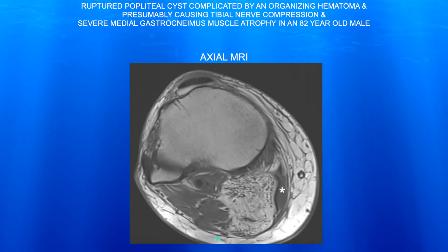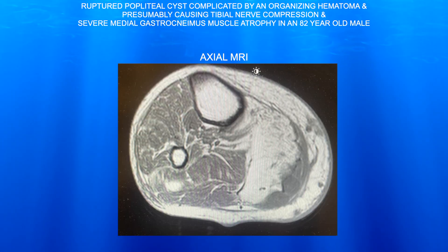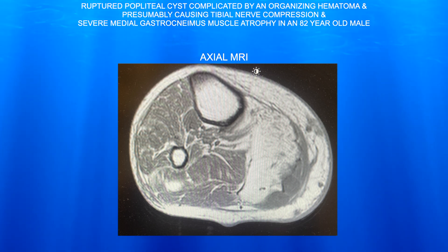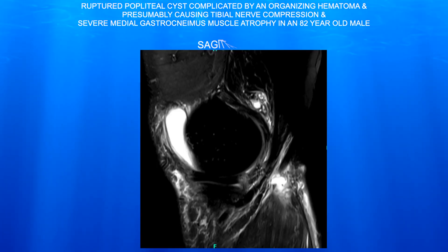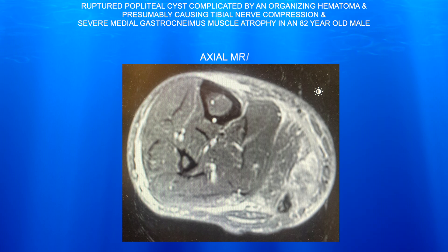This is a ruptured popliteal cyst in an 82-year-old male that caused significant atrophy of the medial gastrocnemius muscle, probably from tibial nerve compression. What's interesting about this cyst is it's probably a combination of serosanguinous fluid and organized hematoma, as this patient is on blood thinners.